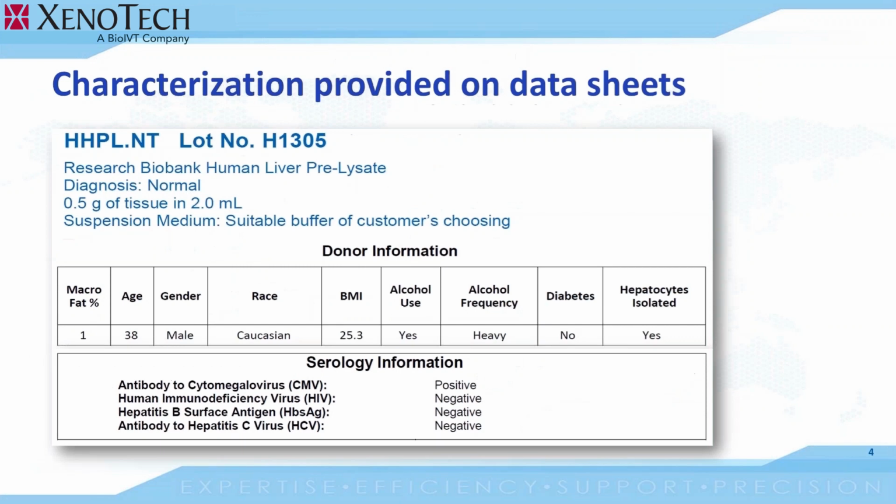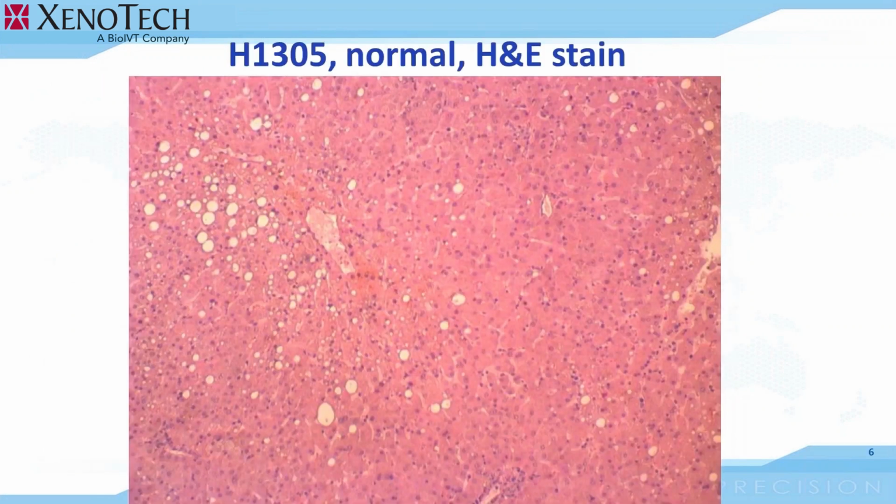In the first image, I'll share with you a view of a normal liver. At first glance, we recognize steatosis in this sample. Fat droplets are bigger than a typical hepatocyte's nucleus. Therefore, this is macrovesicular steatosis.